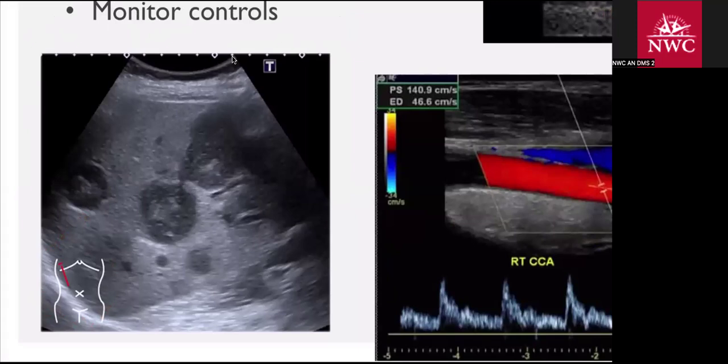Aside from that, whenever you're scanning something that may be a little off your normal beaten path, maybe outside of your protocol, say the patient has a funny little lump on the right side of their abdomen, or on the right side of the jaw. You did your normal protocol, but now you're trying to image that structure. Because you don't have a protocol for it, you want to use your body marker to show the doctor where you're at. You can see here they used the body marker of the abdomen, and those red lines indicate exactly where the transducer was placed.